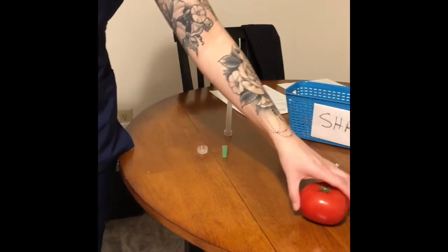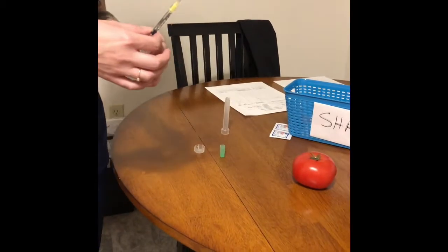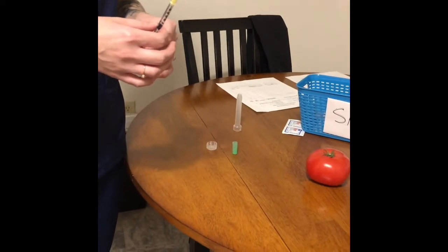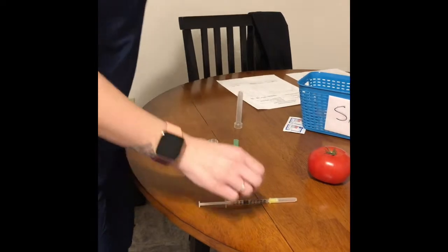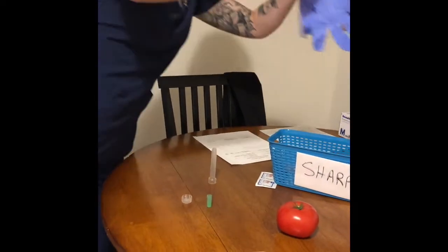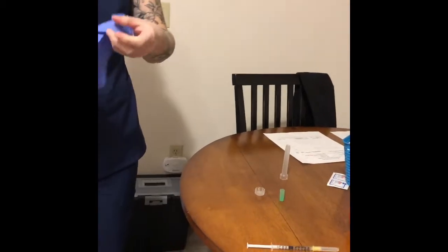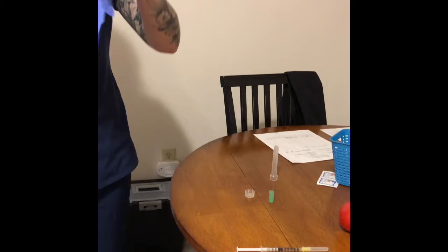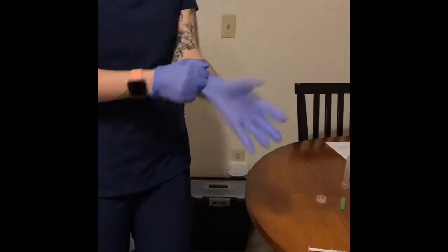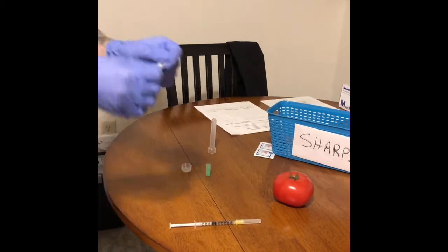So I have my patient here. I'm going to get them in position. There. Pretend my tomato's laying down. Okay, so then I'm going to get some gloves on. I'm going to get my alcohol swab.